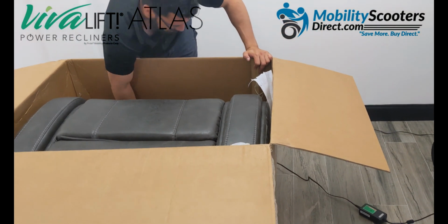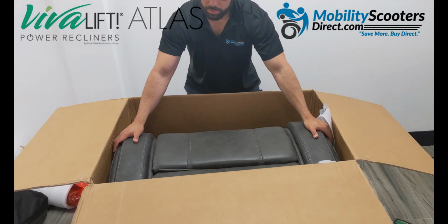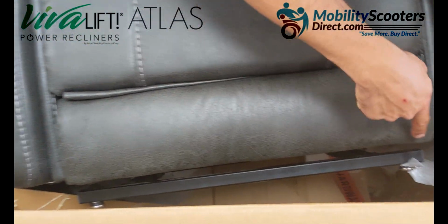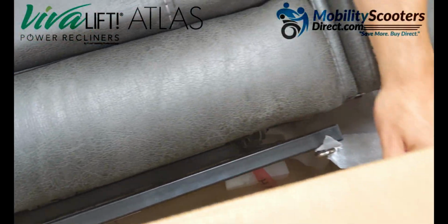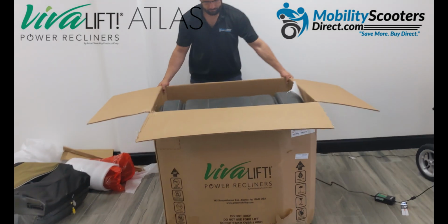Once you've identified which way the chair is positioned in the box, you'll want to go ahead and locate the feet of the chair. You can see the feet there along the railing, which is the bottom part of the frame that rests on the floor. And what we're going to do now is tilt the box forward so that the chair is actually sitting on its legs while in the box.